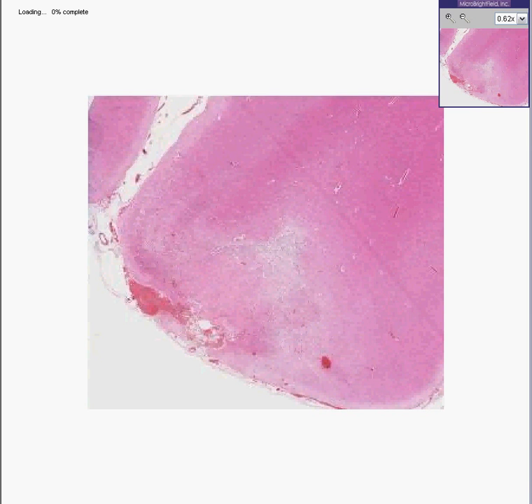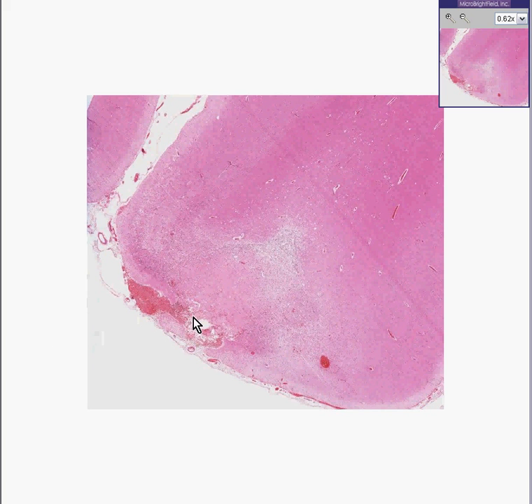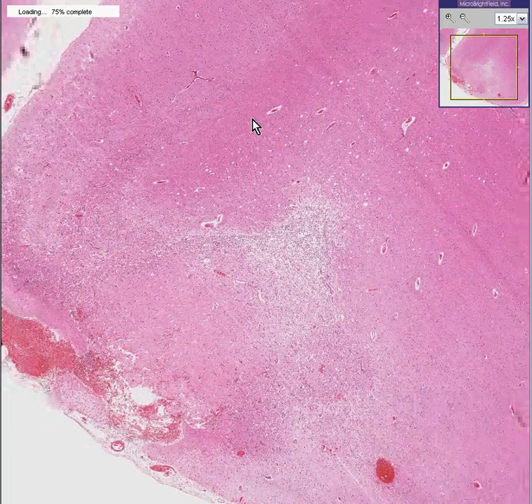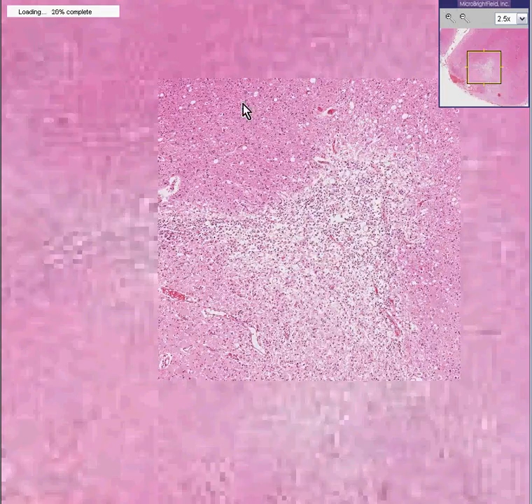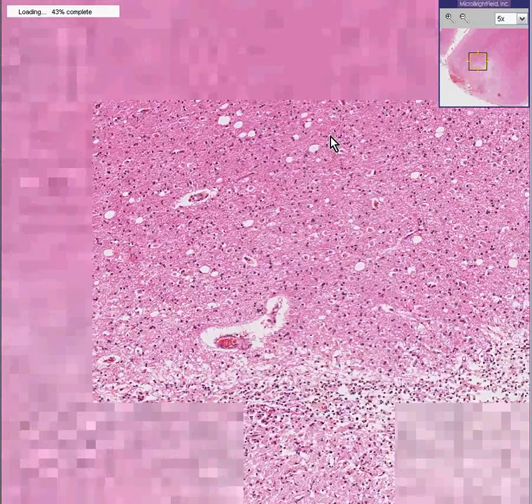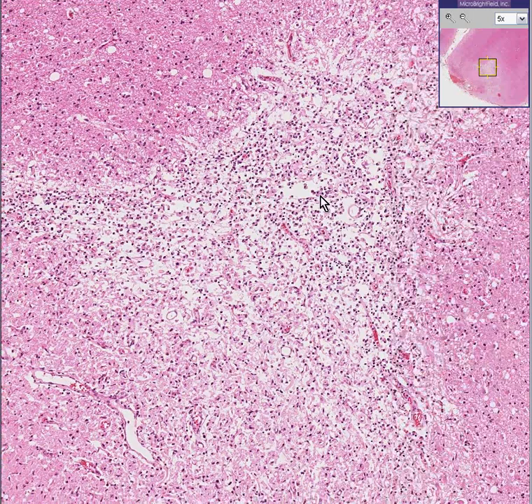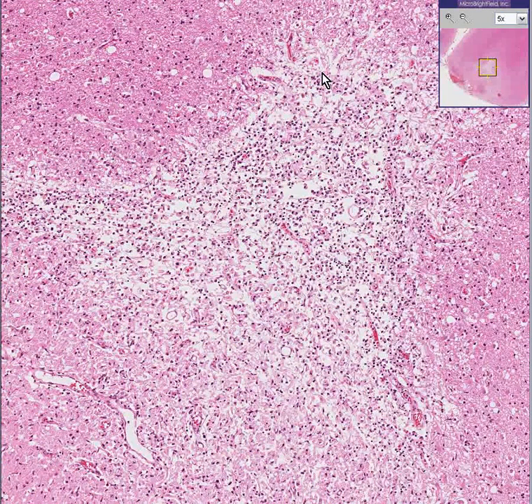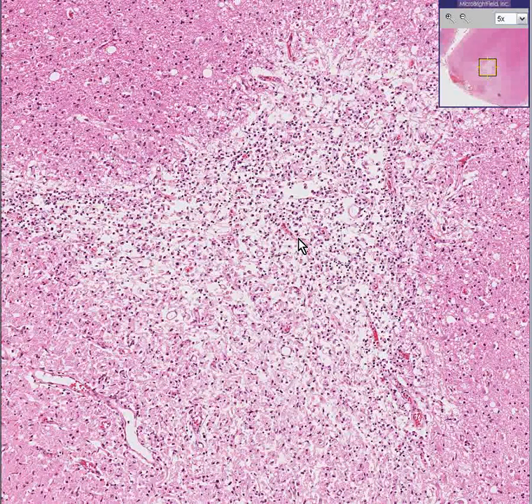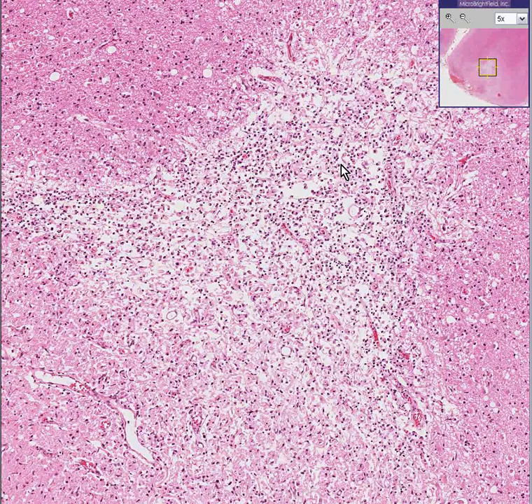Microscopically, a brain contusion might look like what you would expect. Perhaps you can see some hemorrhage, perhaps you can see some edema — and that's exactly what we're seeing here. This area is relatively normal, but in the area of the contusion you see three things: an increase in the number of glial cells, an increase of fluid, and because of that, a relative loss of myelin or demyelination. So edema goes hand in hand with demyelination and gliosis.